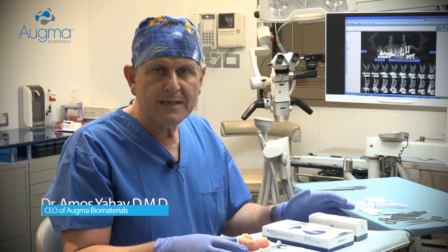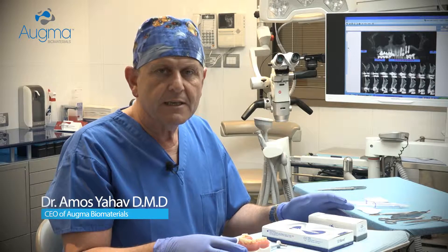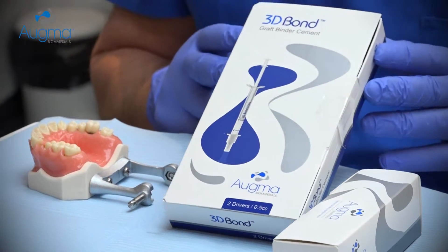I'm Dr. Amos Yahav. I myself am a clinician, the inventor of the biphasic calcium sulfate and the CEO of Augma Biomaterials. Today I would like to demonstrate how to work with 3D-Bond bone graft cement.